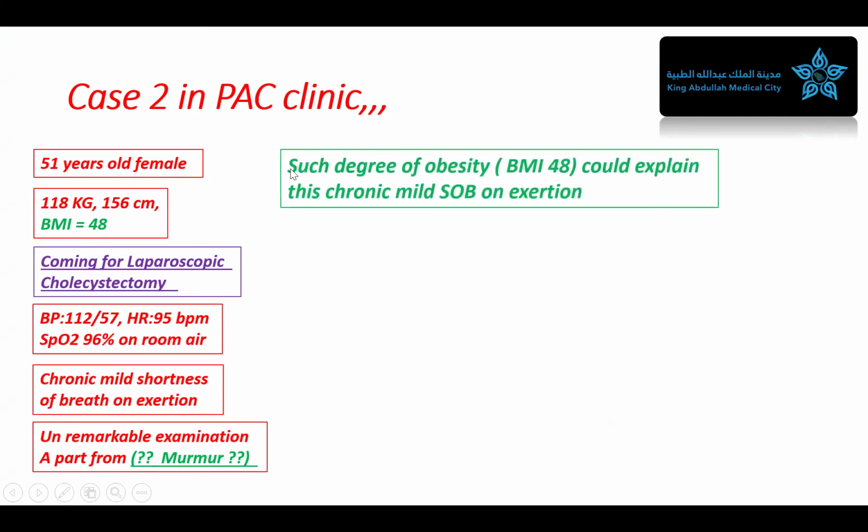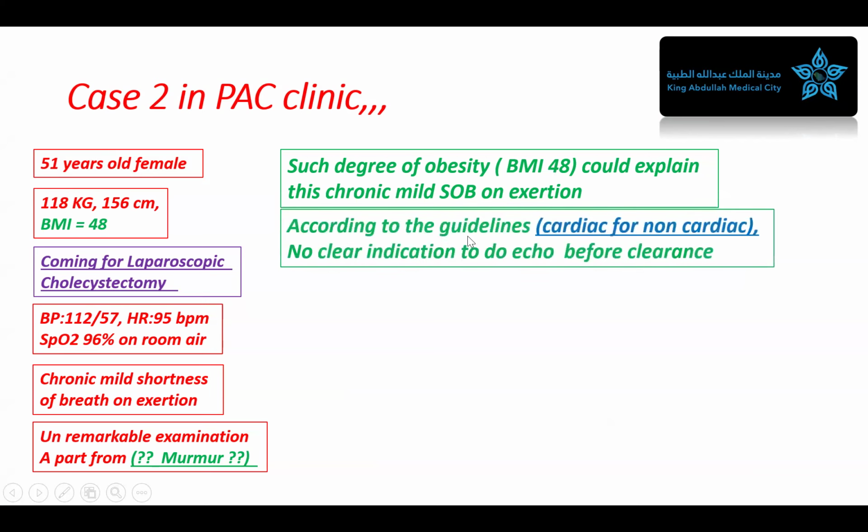Now let's think about the decision to clear the patient. I can say that such a degree of morbid obesity could explain this chronic mild shortness of breath on exertion. According to the 2022 European guidelines for cardiac evaluation for non-cardiac surgery, there is no clear indication to do echo for this patient before clearance.